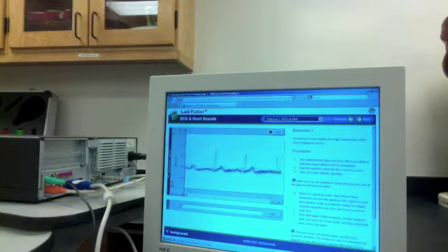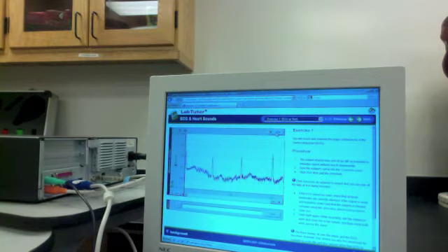Now, it's recording all of this. You might not be able to see it from here, but it now says we're at about minute 30. So it's recording this entire bit of data. I can stop this at some point, and all that data is saved. So I'm going to take my electrodes off, and hopefully this will make things a little bit easier to see. It will tell you on the next step what to do. So I'm going to go to the next screen, and you just go to next.